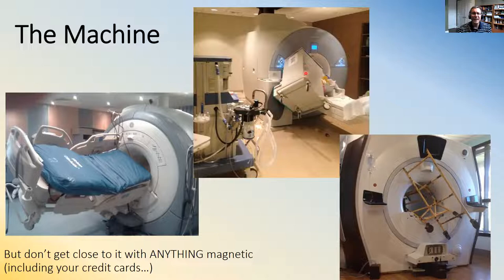But if there's anything magnetic in here, that magnetic field from the MRI machine is going to grab that thing and pull it right on in. That can make it dangerous. So when you go for an MRI, I've talked to the technicians who administer these several times. They will ask you many, many questions to really make sure you don't have anything metallic on you at all. It's really important when you go into that room.